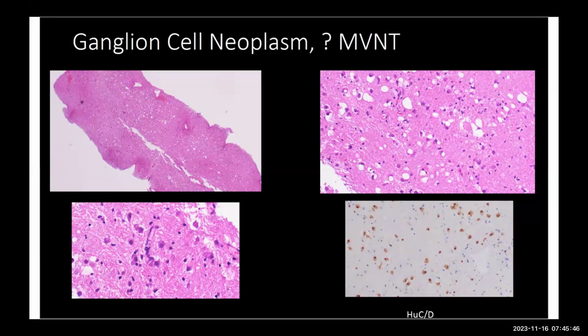They group, they cluster, and some of them have ballooning inside them, or some kind of cystic change within the cytoplasm. Some of them had binucleation, and one of the stains called HuD, which is a neuronal marker, shows these cells to be positive beautifully on the right lower picture.